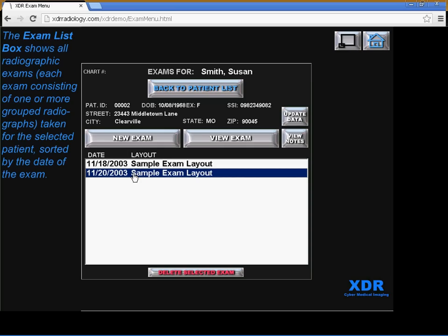And the exam list shows all of the different exams with their dates. Each exam consists of one or more grouped radiographs taken for that selected patient, sorted by the date of the exam.